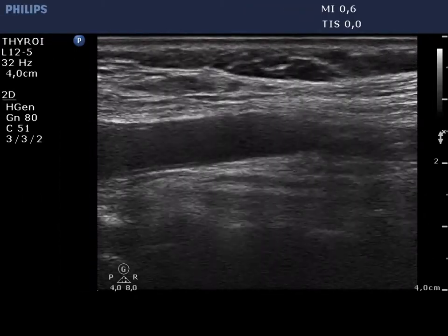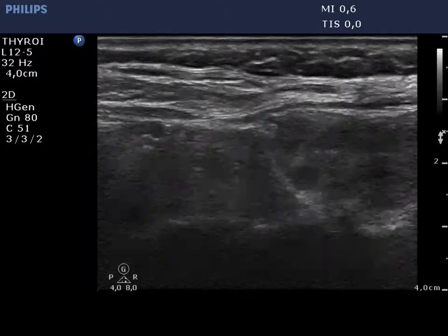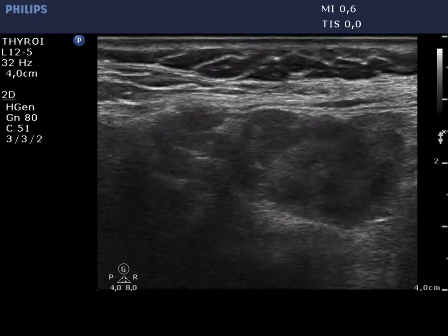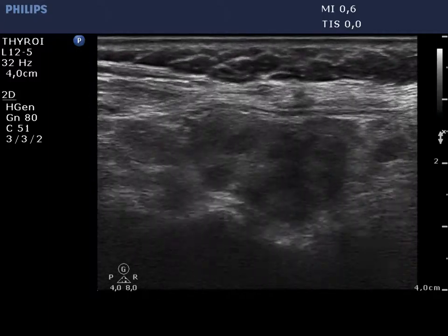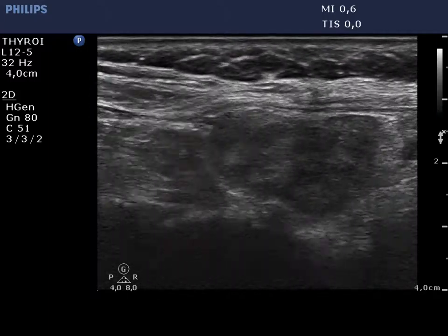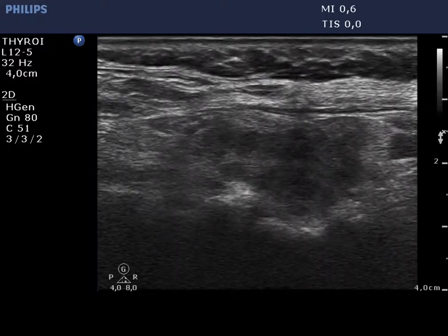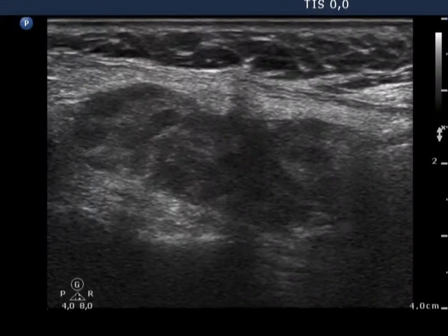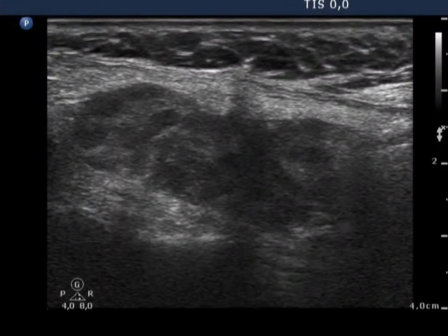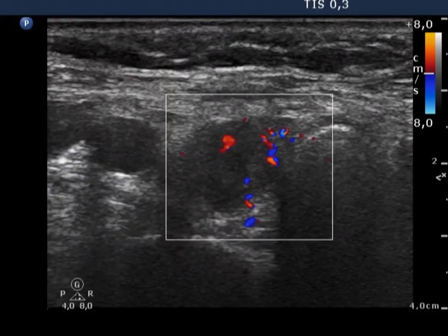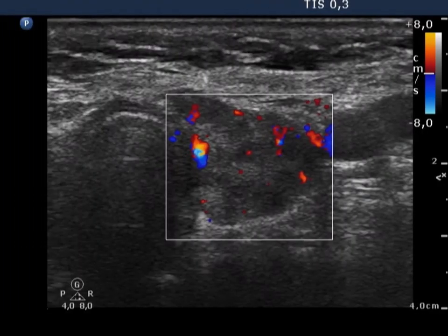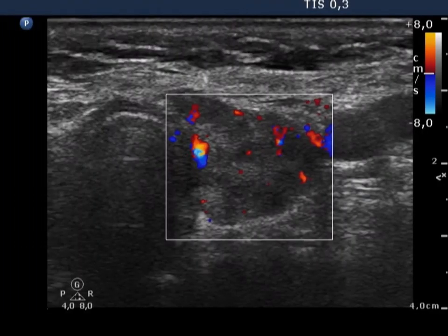The left lobe has a similar echo pattern. It is worth taking note of this very special pattern of an operated thyroid. The vascularization is a little bit increased.